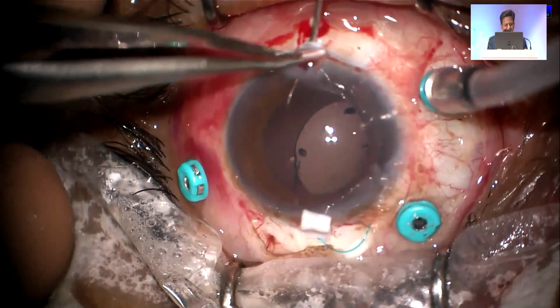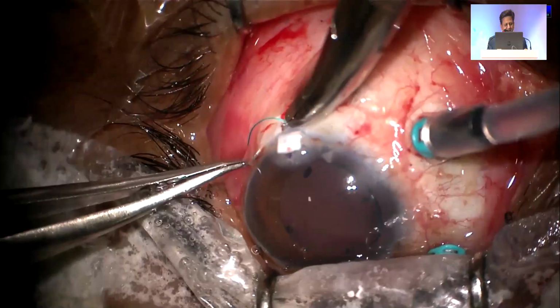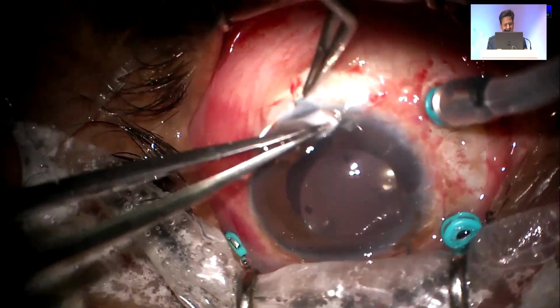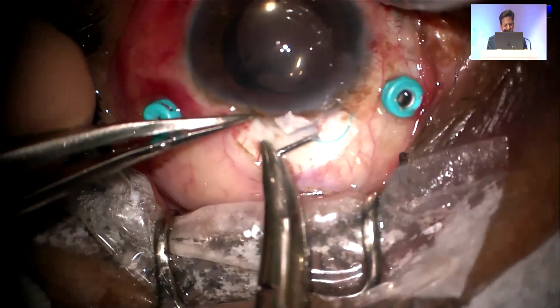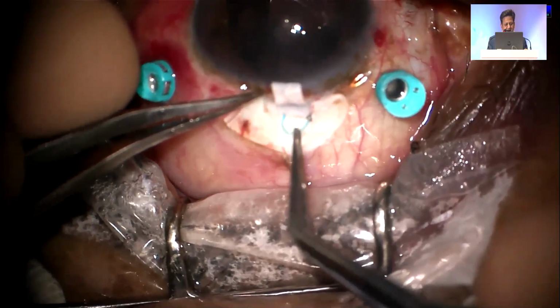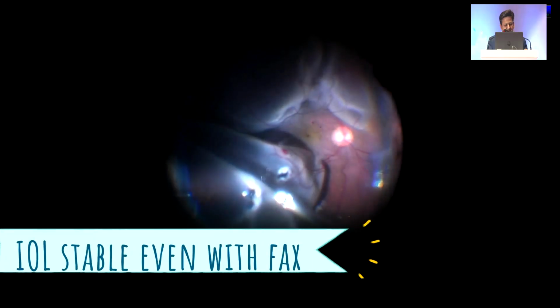The flaps were created, and the sclerotomies were done, and the haptics were brought out and buried into the scleral pockets. And once this lens is stabilized, if you have a proper capsule, you can put it on the anterior capsule, and then you proceed with the management of the retinal detachment here.